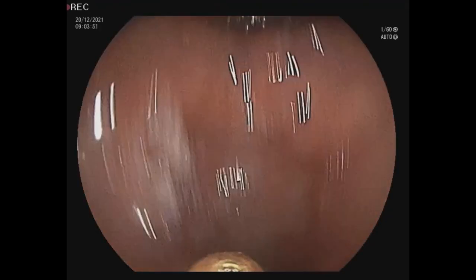In this video you can see how we used endoscopic forceps to cross the tumor. Now we are in the stomach.